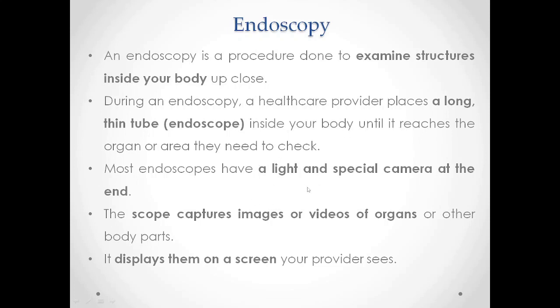They have a light with a special camera at the end. The scope is the instrument at the tip, right? It captures the image or the videos of the organs or any other part you desire. This is connected externally through a screen wherein your healthcare provider will see what is shown by that endoscope. So in parallel the display is seen.